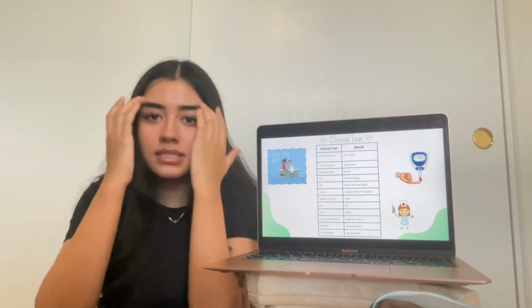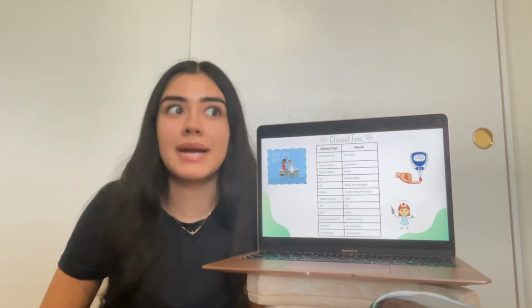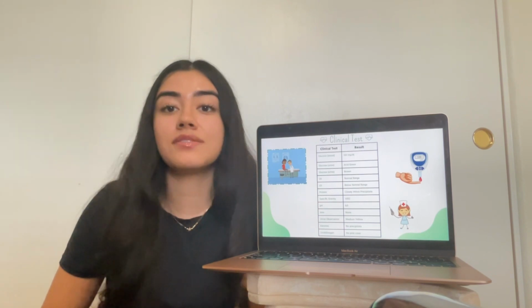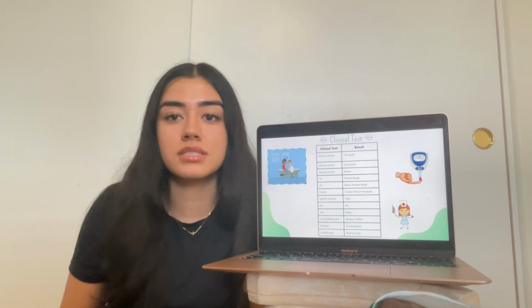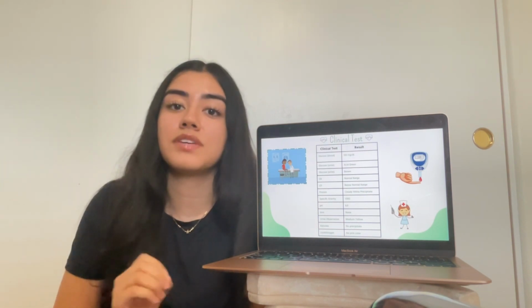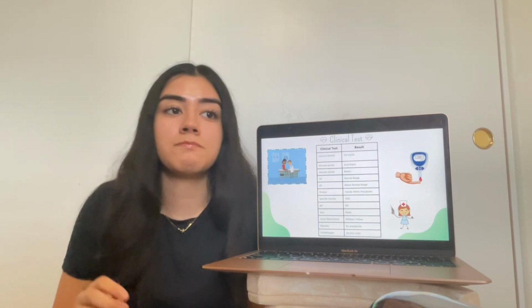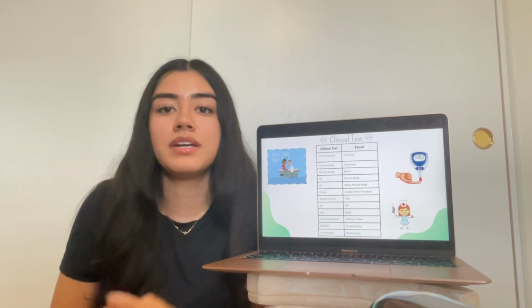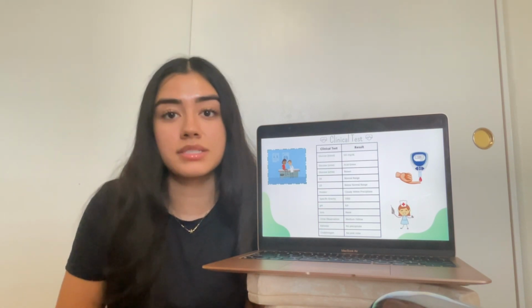Tests for the ketones and the urobilinogens both came back negative, indicating no abnormal color changes in the test. These results are important as the absence of ketones is reassuring. And urobilinogen findings suggest no significant liver dysfunction or excessive red blood cell breakdown.